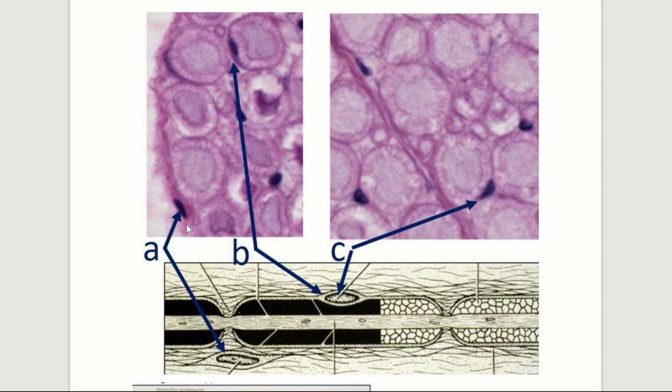And so that's what's happening here as well. So this is a fibroblast, okay? This is a fibroblast lining an individual axon, and so that is considered endoneurium. So it's making all of this connective tissue, all of this collagen around this axon. So this is a fibroblast, also making the endoneurium.